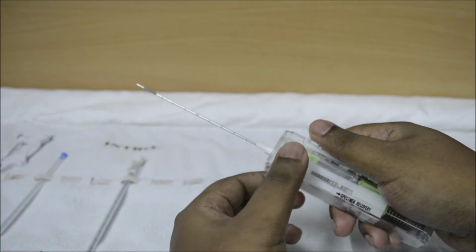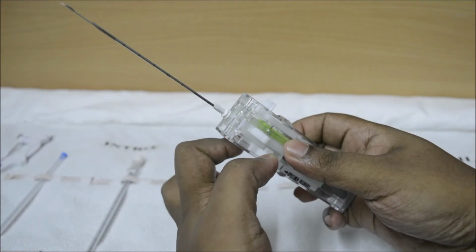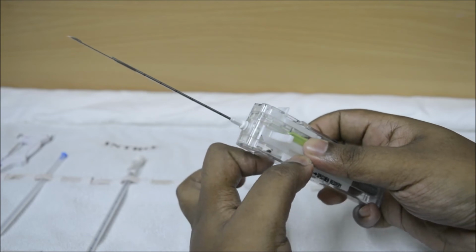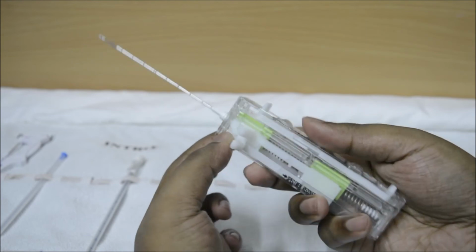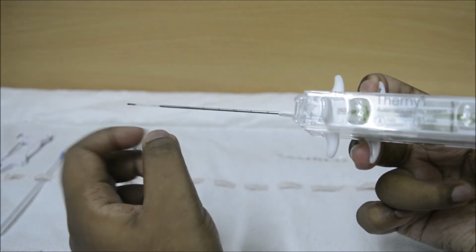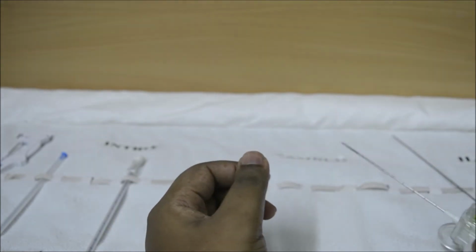Now how to collect this specimen? The needle is taken out, then only the lower trigger is pulled. And as you can see, as I am pulling the lower trigger, the sample collection tray is getting exposed. Now holding this lower trigger, a scalpel can be used to remove the tissue to the specimen collection tube.